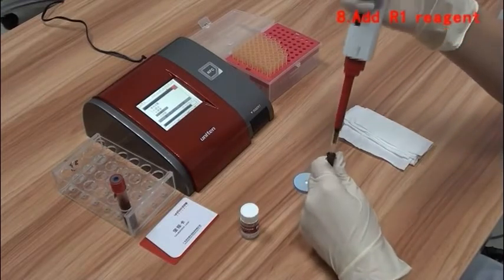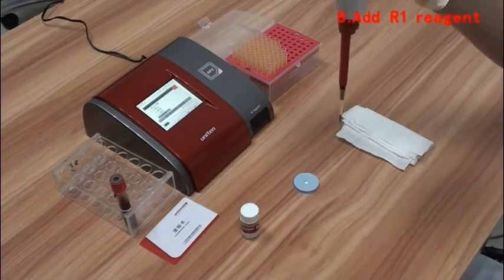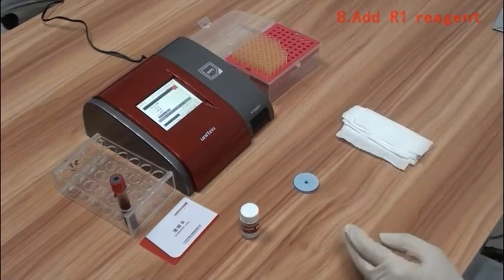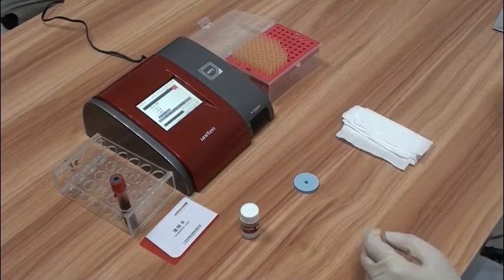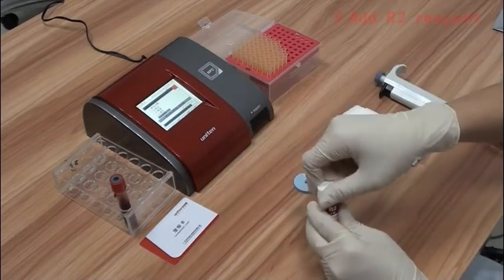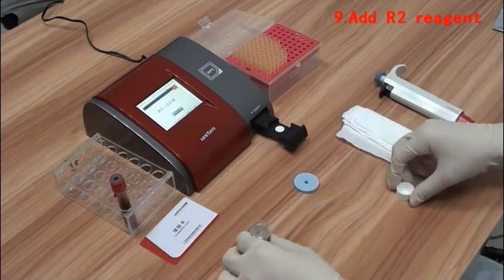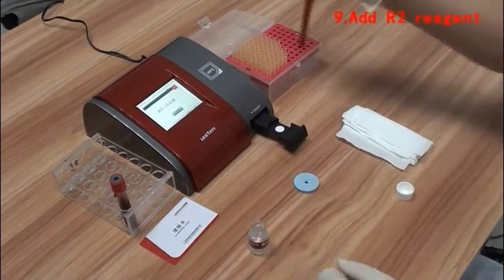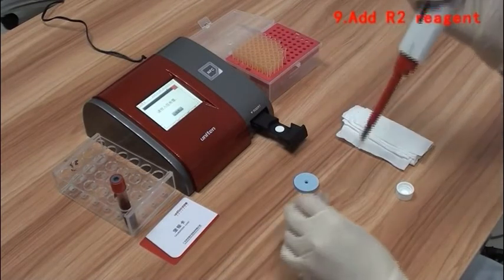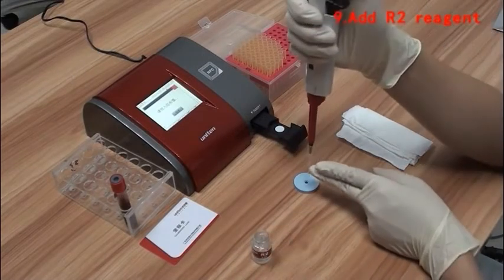Use the pipette to extract 25µL of mixture from the R1 reagent test tube and transfer it into the cartridge at a fast, constant rate. After the mixture has been totally absorbed, add 25µL of R2 reagent to the cartridge.